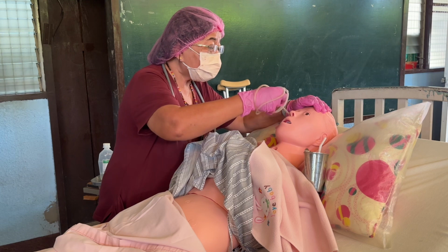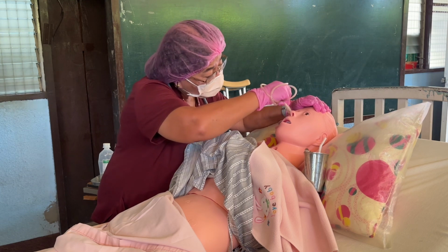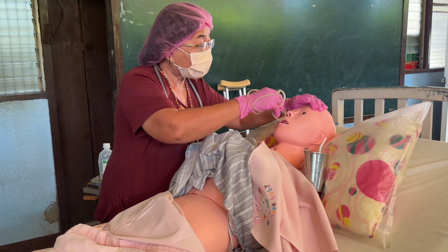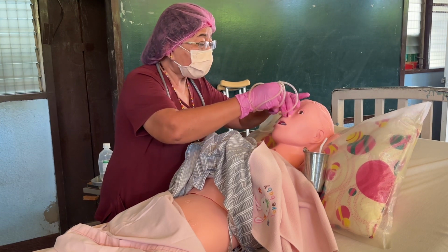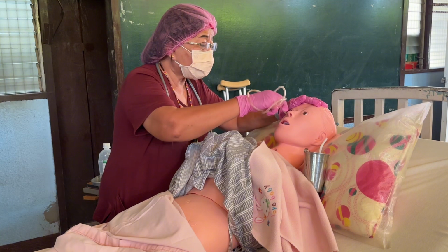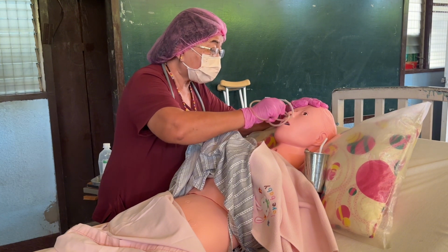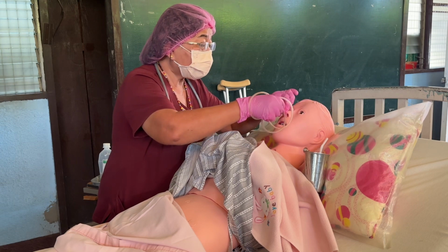Okay. So it already reaches the mouth. Ma'am, kindly open your mouth. So it's not curled there. Okay, ma'am, kindly hold the glass and take sips of water. Then once the patient is sipping the water, you still advance it. Advance, advance, advance. Okay? So it's only up to there.